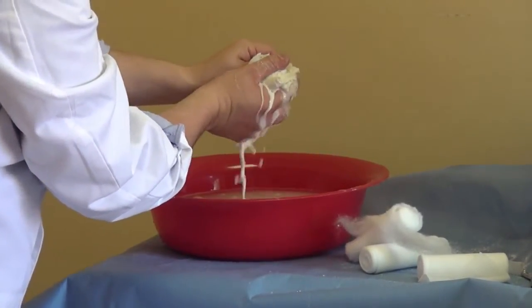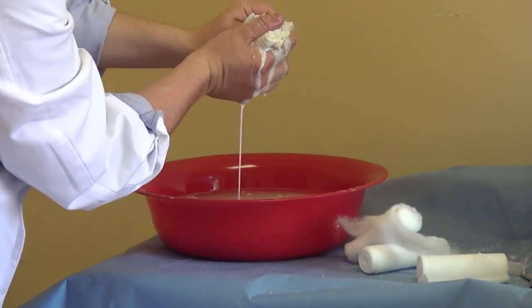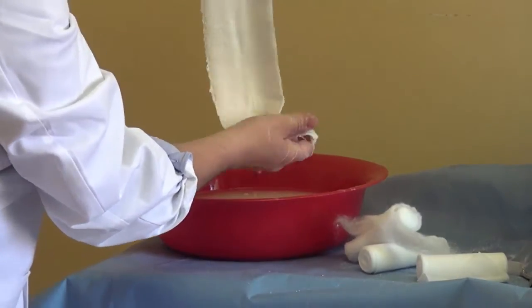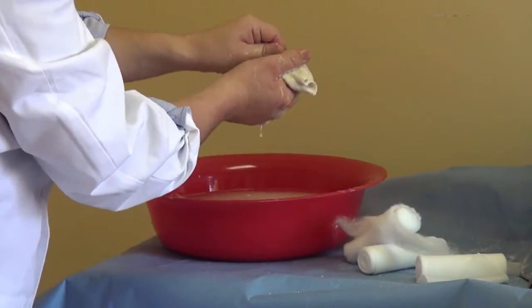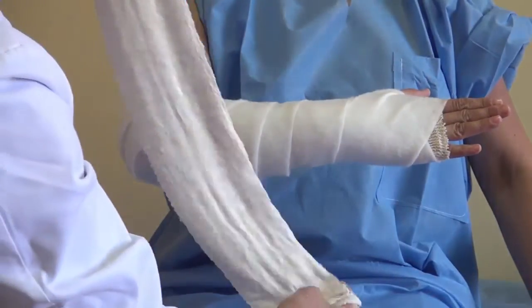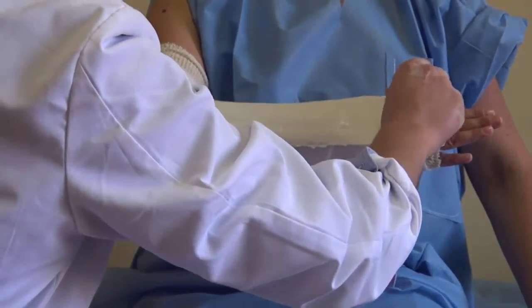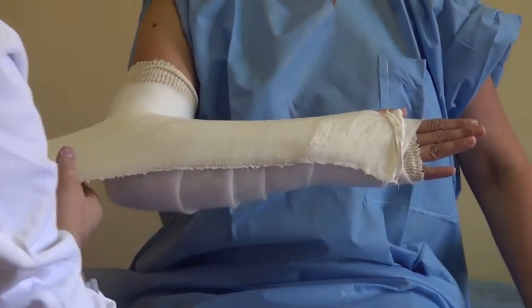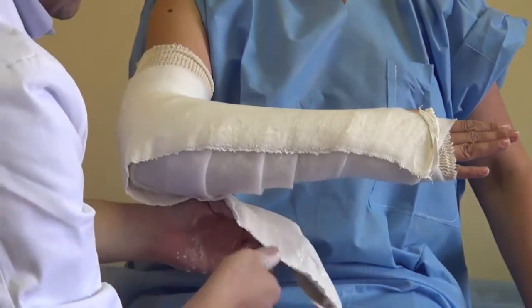It doesn't have to be very wet — you can squeeze out a lot of water so it's a little dry. This also takes less time to get very hard. We then place the tip of it over the border of the metacarpal area and go around.